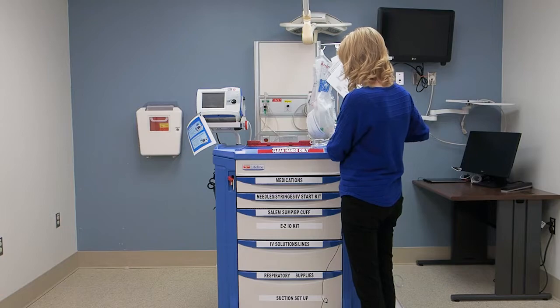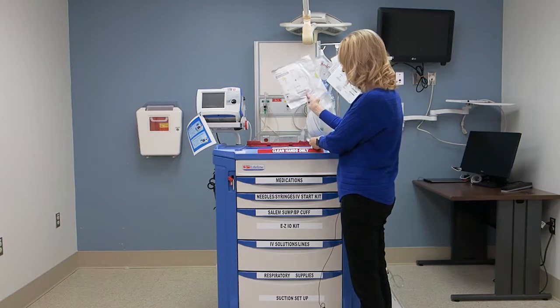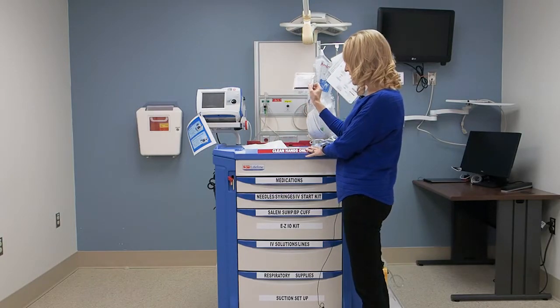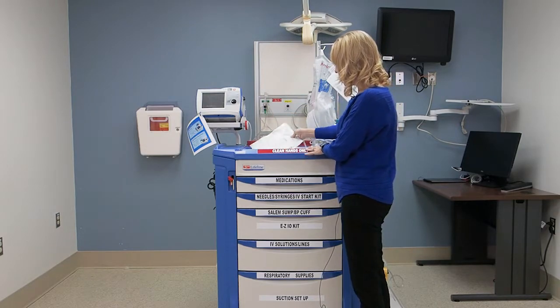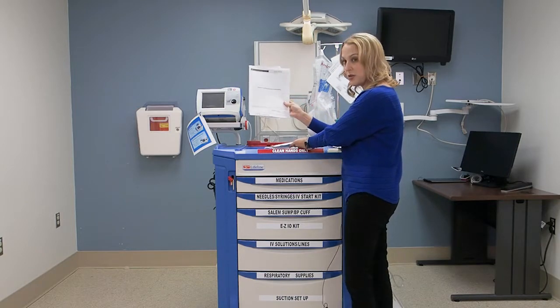Inside this top bin, we have several things. You're going to find an extra set of defibrillator pads for use. You're going to find some electrodes if you need to use the monitor function. And then also, one of the other important things that you may find is the CPR record form.